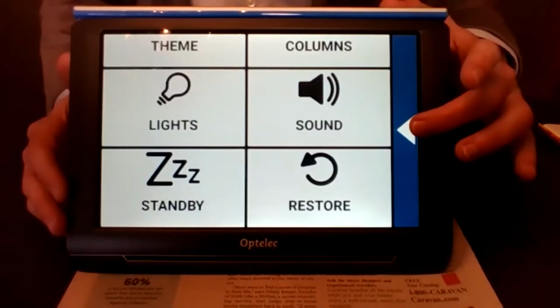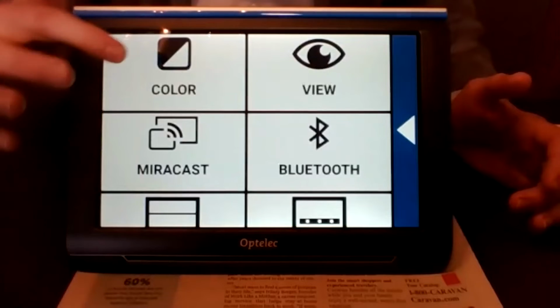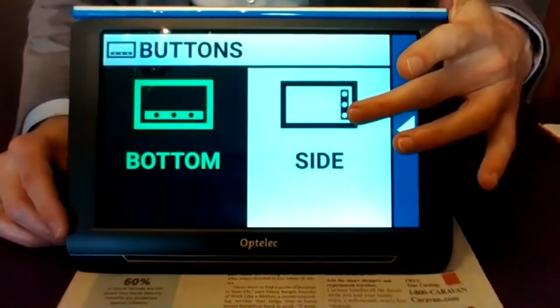But go back up. The reason why I came in here to begin with was that one right there, buttons. Because we were talking about the controls, third down, yes. Right. Because again, the orientation of where the buttons sit.